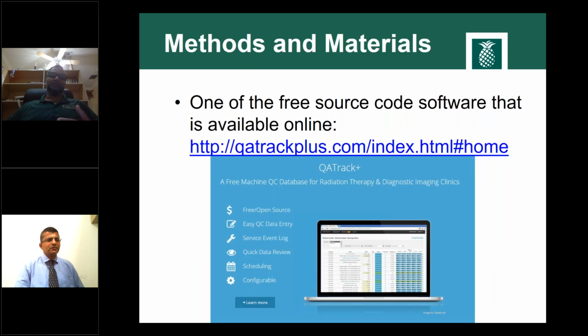And you may be thinking that when we are working in a small clinic which is constrained in budget and expenses, how are we going to accomplish this? So this is a software which I want to introduce, which we are going to roll over into in the near future: QAtrackplus.com. You can see that I just have a screenshot of their front page, and that's open source code. They have written the program in Python, and this is QA data entry, service event log. For example, the field service engineers send reports after they do their work. We can actually enter all that service event log and the reports, attach the reports.